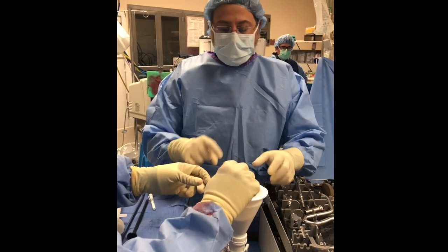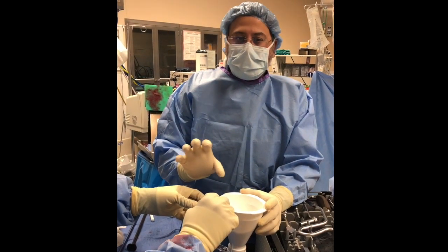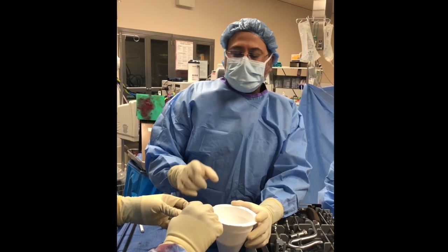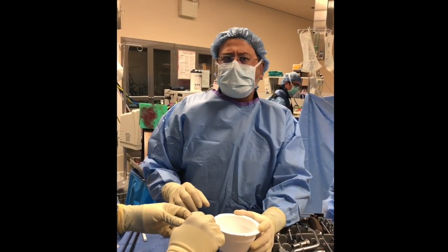We're making an antibiotic nail. We got the cement in here — one package. We put a gram of tobramycin cement. You can put a gram or two. We use a gram because otherwise it gets a little too thick.